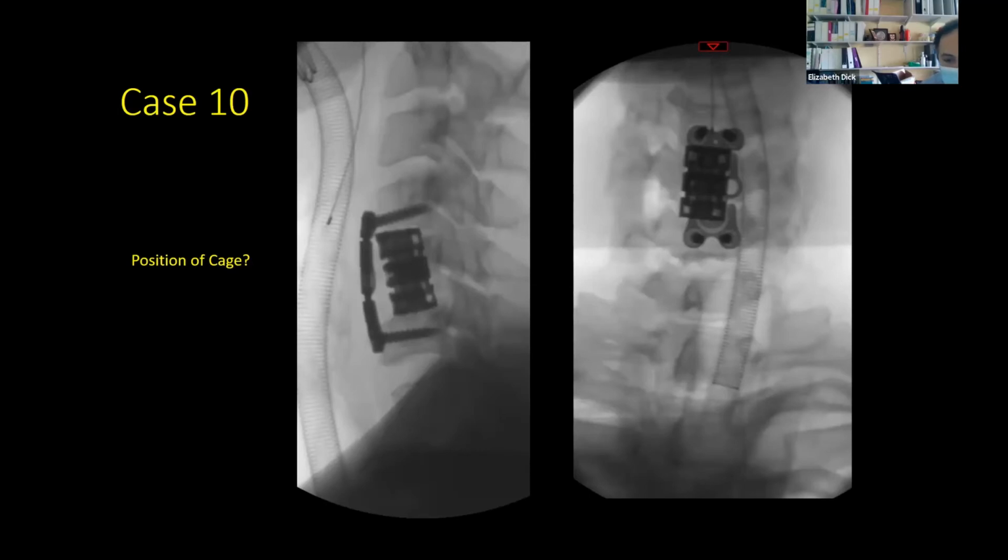He went headfirst into a tackle in the scrum. He came off the worse for it, and you can see he's got a burst fracture of the C5 vertebra on the previous image. Already the canal was slightly compromised, although neurologically he was intact. And so the possibility here is that with time, if he was conservatively treated, there would potentially be a worsening loss of lordosis, and then potentially more compression of the spinal cord and canal at that level.